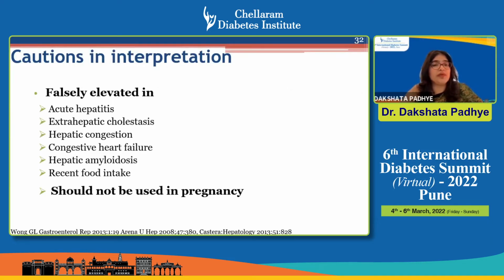Now, there are some situations where we should be careful. It shouldn't be used in pregnant patients. And in a NASH or NAFLD patient who has coexisting acute hepatitis, hepatic congestion, or hepatic amyloidosis, it can be falsely elevated. So we have to be careful in such situations.